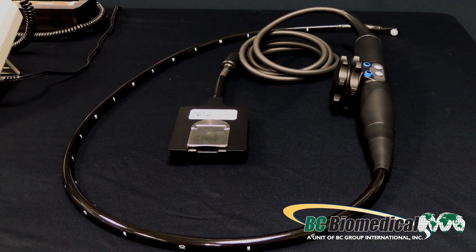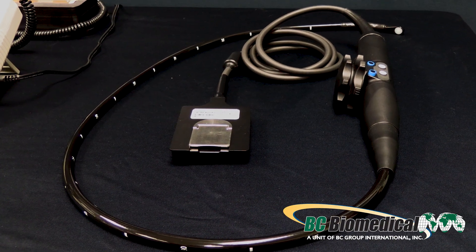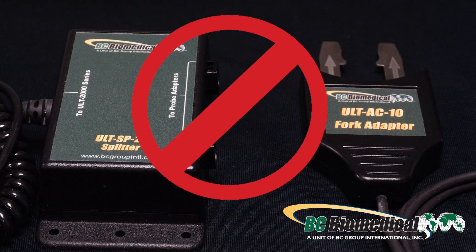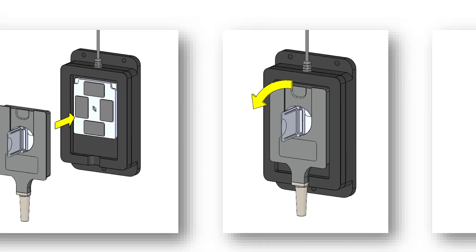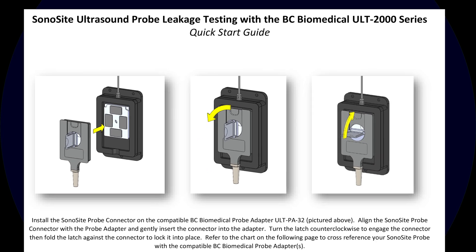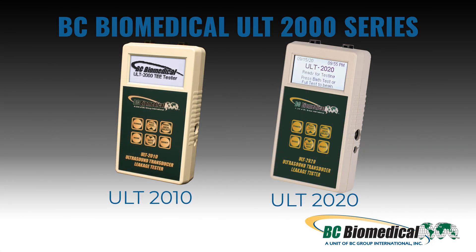For the Sonosight T8-3 transducer you do not need to use the ULT-AC10 fork adapter or the ULT-SP20 splitter. Prior to testing please review the quick start guide labeled Sonosight ultrasound probe leakage testing with the BC Biomedical ULT-2000 series.